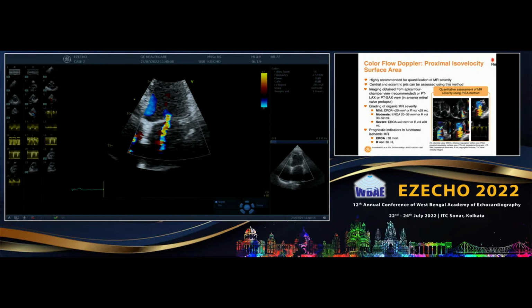And what you have to do now is zoom this. This is very important. Can you do the post-process zoom also? Post-process zoom is also okay for me. I want extreme zooming. That is the maximum zoom in this machine. It's a T9.